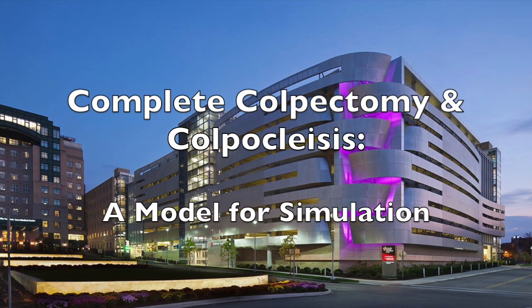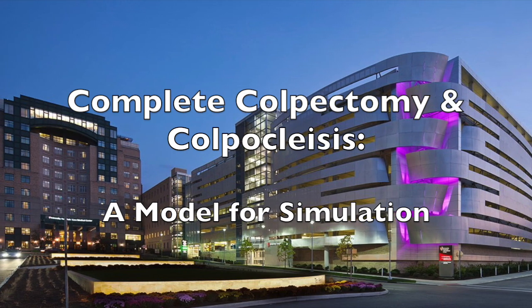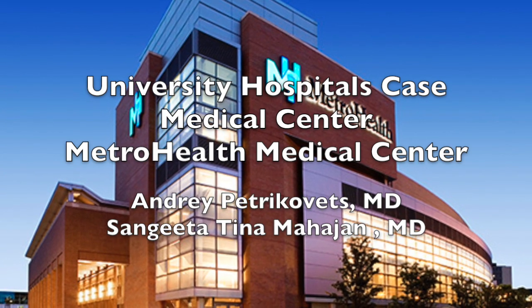Complete colpectomy and colpocleisis: a model for simulation. A collaborative effort between University Hospitals Case Medical Center and Metro Health Medical Center.